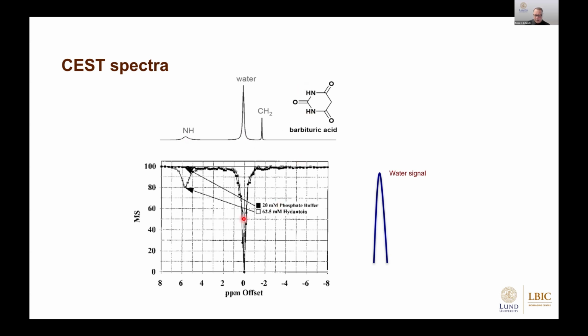So now we do that exercise that I just said. We have a saturation pulse set on frequency, and we start pulsing continuously. Well, over here, there's no exchange, so nothing will happen. We can move our frequency to CH2, and they are not communicating apparently because nothing is happening on the water signal. So no protons of the CH2 are leaving the CH2 group and being bound and exchanged with water. Then we get to the water signal. Well, signal is gone, is not really what we want to see. We continue our frequency, and the water signal will come back.